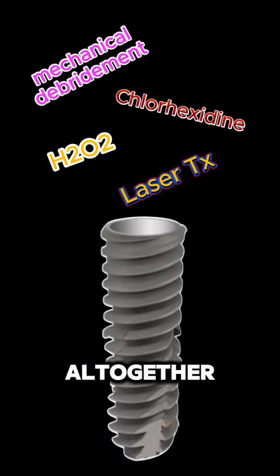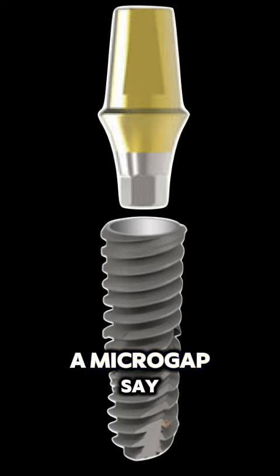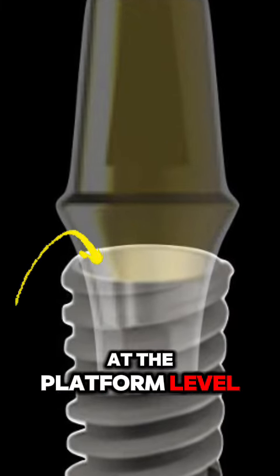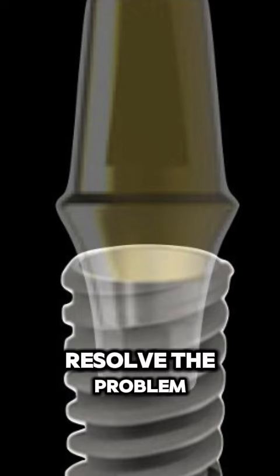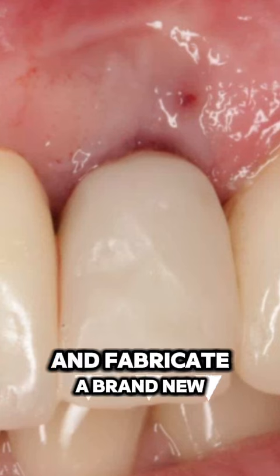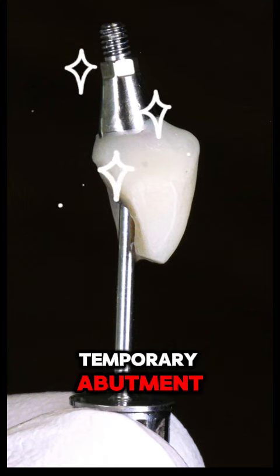the implant altogether. However, if the source of the infection is coming from a microgap, say between the prosthetic and the implant at the platform level, then basically eliminating that microgap should resolve the problem. So in a case like this, you can easily remove that temporary abutment and fabricate a brand new temporary crown with a new temporary abutment.